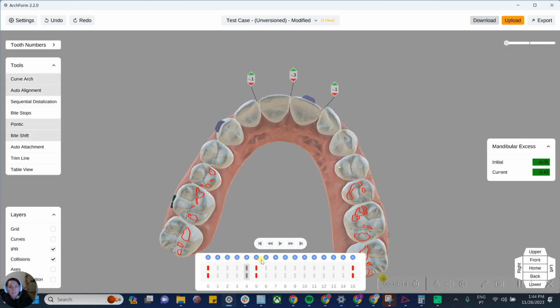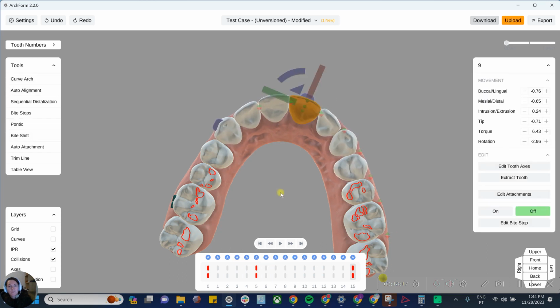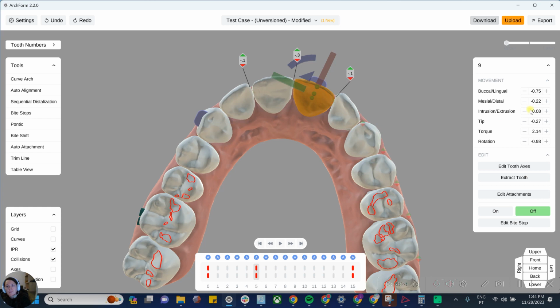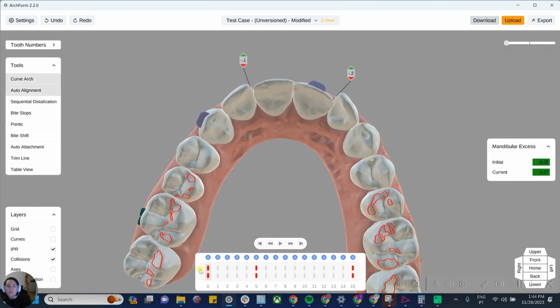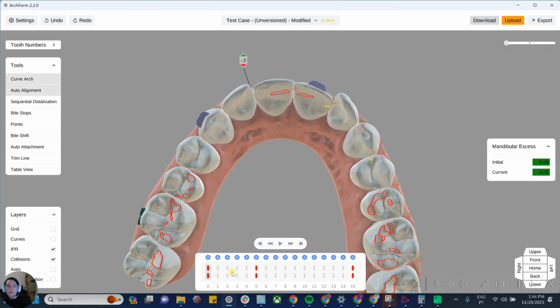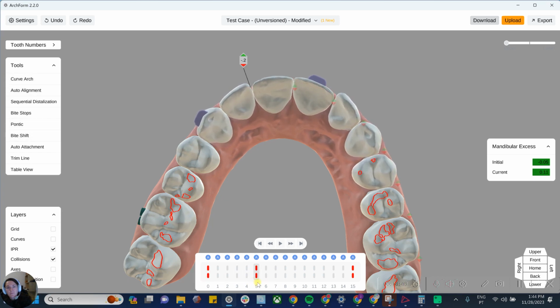So actually, if you watch tooth number 2-1, it's just moving forward. The main goal is just to move forward. I don't know why it has this mesial distal movement. So I'll just speed up the forward movement in the initial goal, and that way we have it aligned already and we have enough space to bring the mesial corner of 2-2 in. So that's kind of what I'm aiming for in the staging. Let me push that one a little bit more.